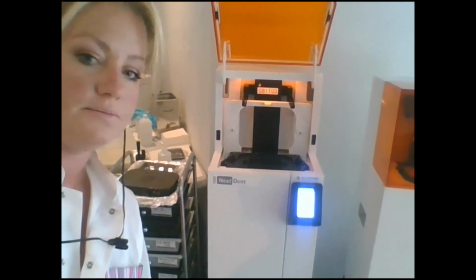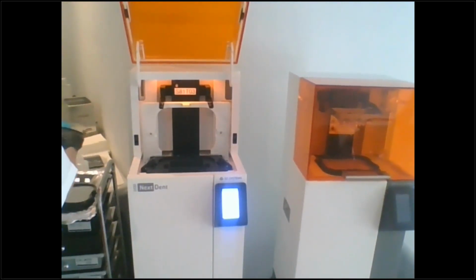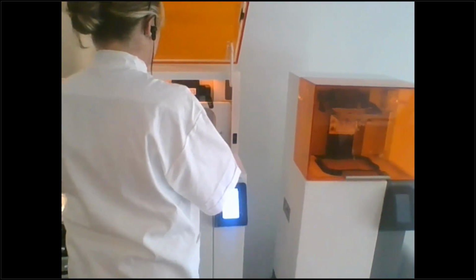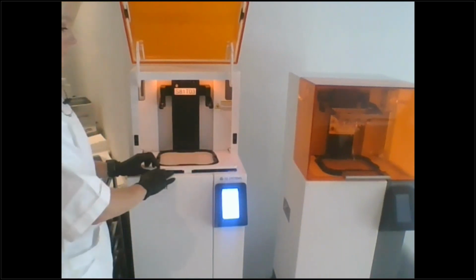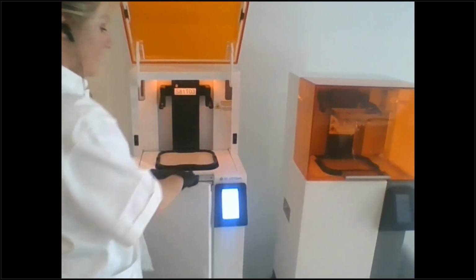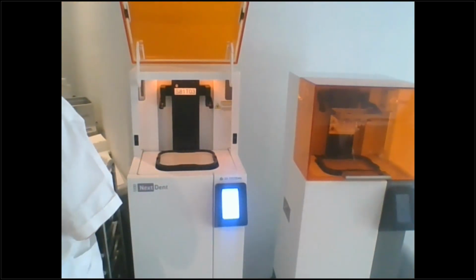So we're going to put in our resin tray now. And this is Model White. And then you'll just close the tension arm. And this tension arm adjusts based on the amount of tension that it needs, okay? So you don't have to worry about breaking it.